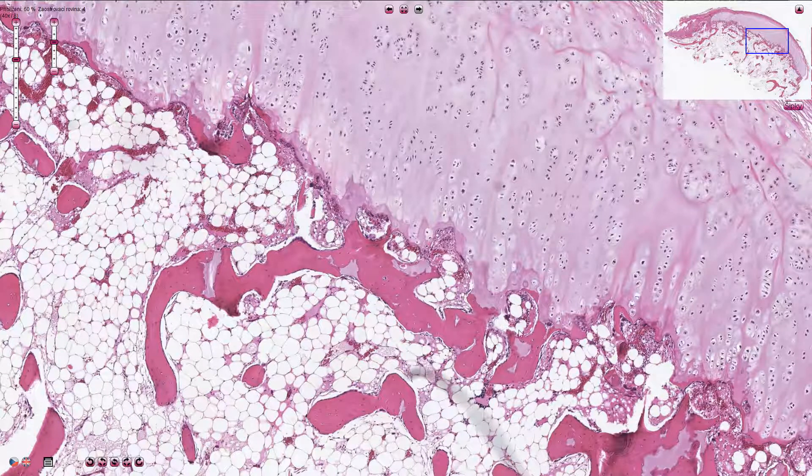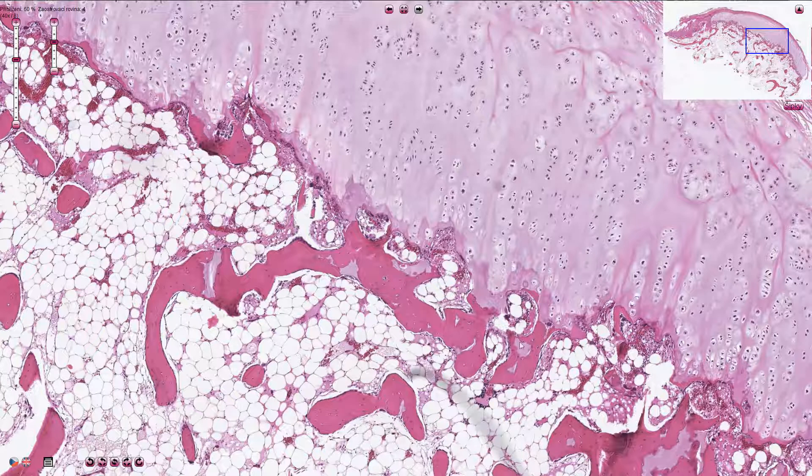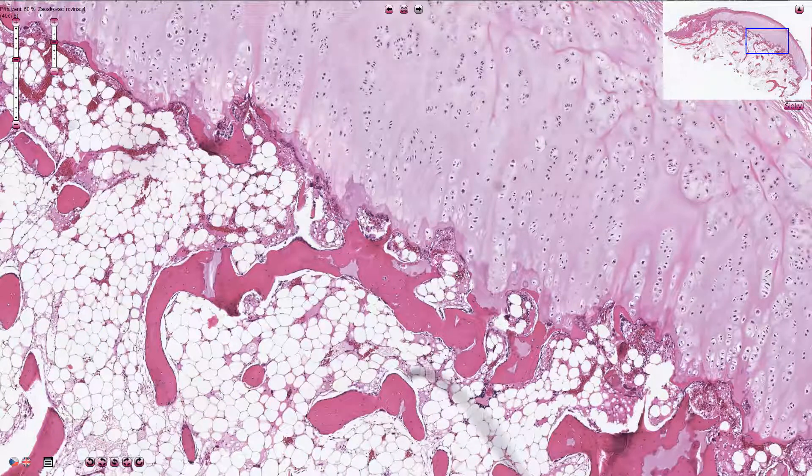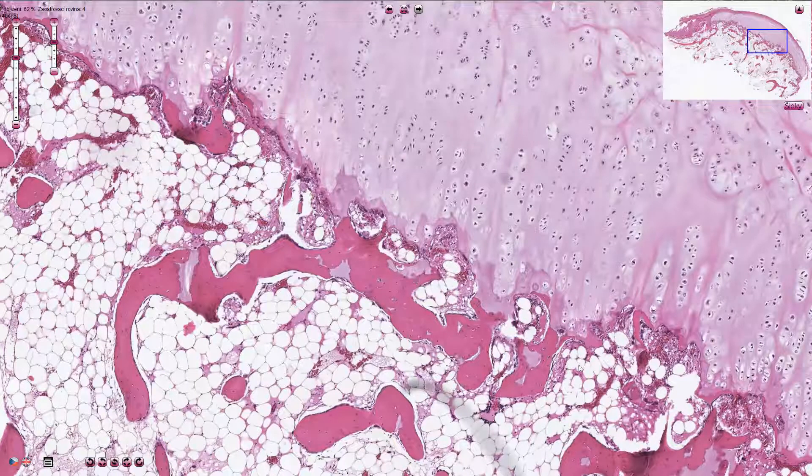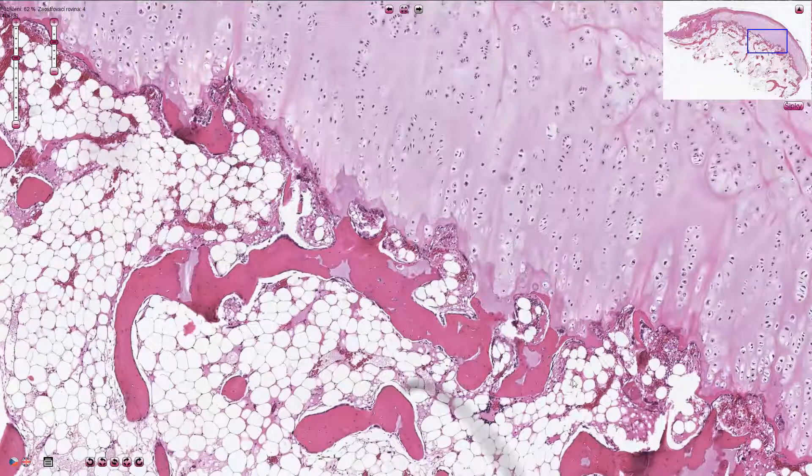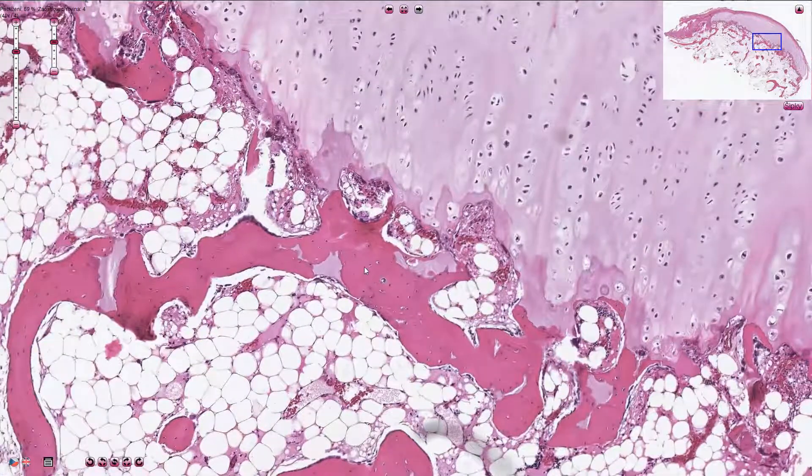Here we have the area which resembles normal endochondral ossification, and this is characterized by transformation of the cartilage into the bone tissue. This area resembles normal growth plate, and here we see ossification and trabecular bone formation.